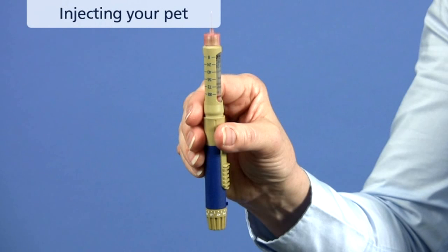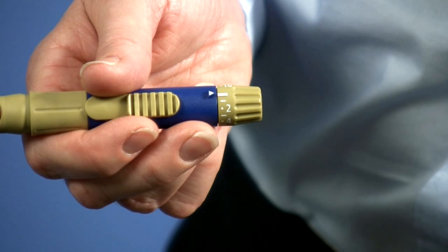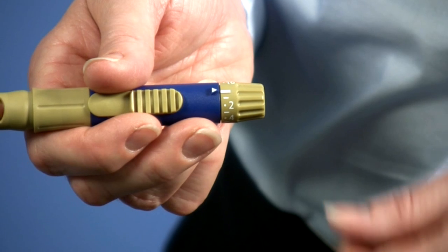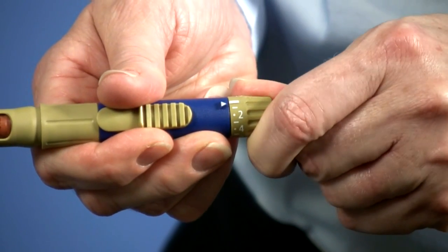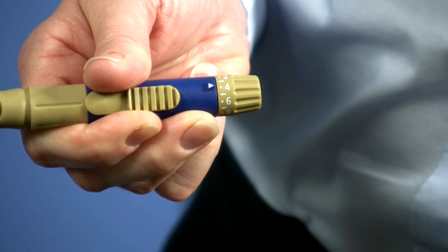Your pet's insulin is now ready for injection. Make sure the arrow on the VetPen body points to the starting line on the dose selector. Select the number of units that has been prescribed by your veterinary professional by turning the dial. Make sure that the arrow points toward the correct number of units on the dose selector before proceeding any further.